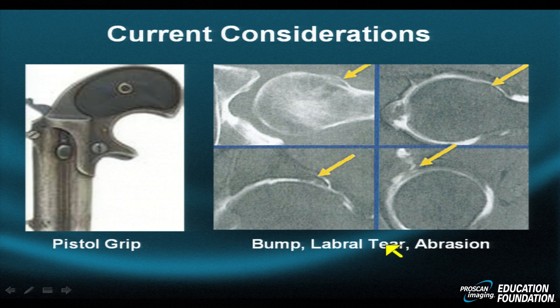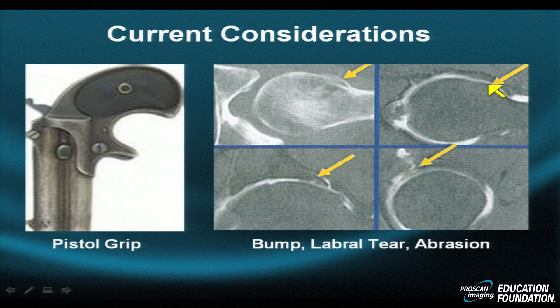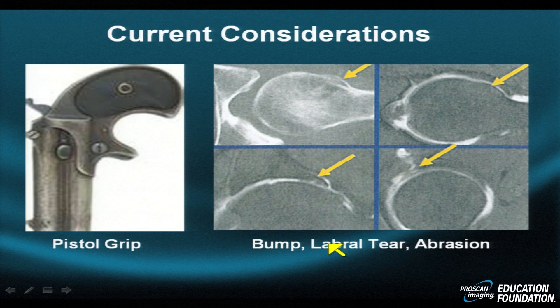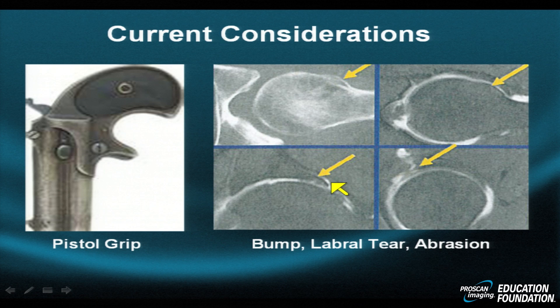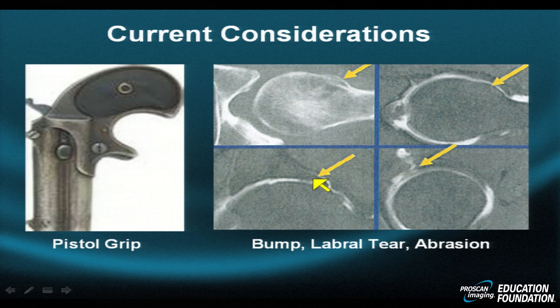Here's a more graphic CT example of a bump. The normal tapered transition is lost, and there is a big broad bump. It has caused shear effects in the superior labrum. The labrum is no longer a well-defined, smooth, corticated structure with a fibrocartilaginous smooth triangle — it has areas of irregularity along its undersurface, looking somewhat brush-border-like.